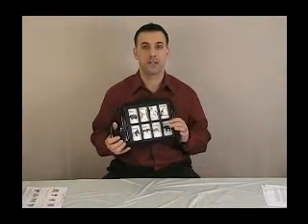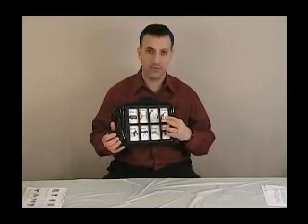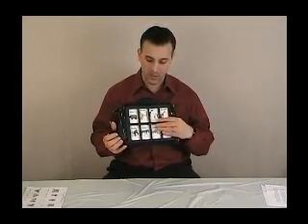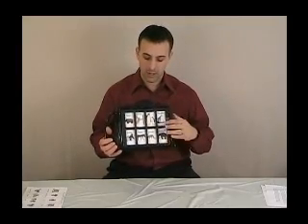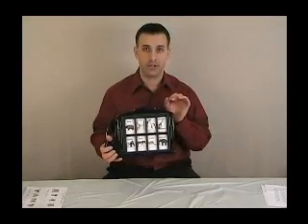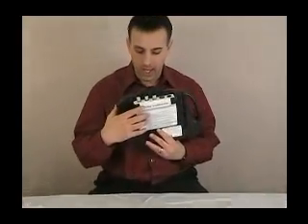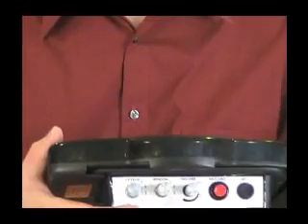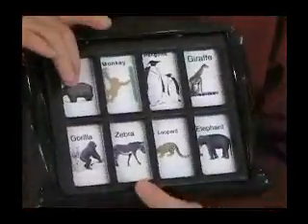This actually has 7 levels and there are different configurations, but right now, for answering our question, this is an 8-window frame. I've recorded 8 individual messages on here. This would be considered one level. On the back of this machine it has a dial to change from 1 through 7, which you can see here, and you select that. For level 1, I have selected this recording just to show you an example.